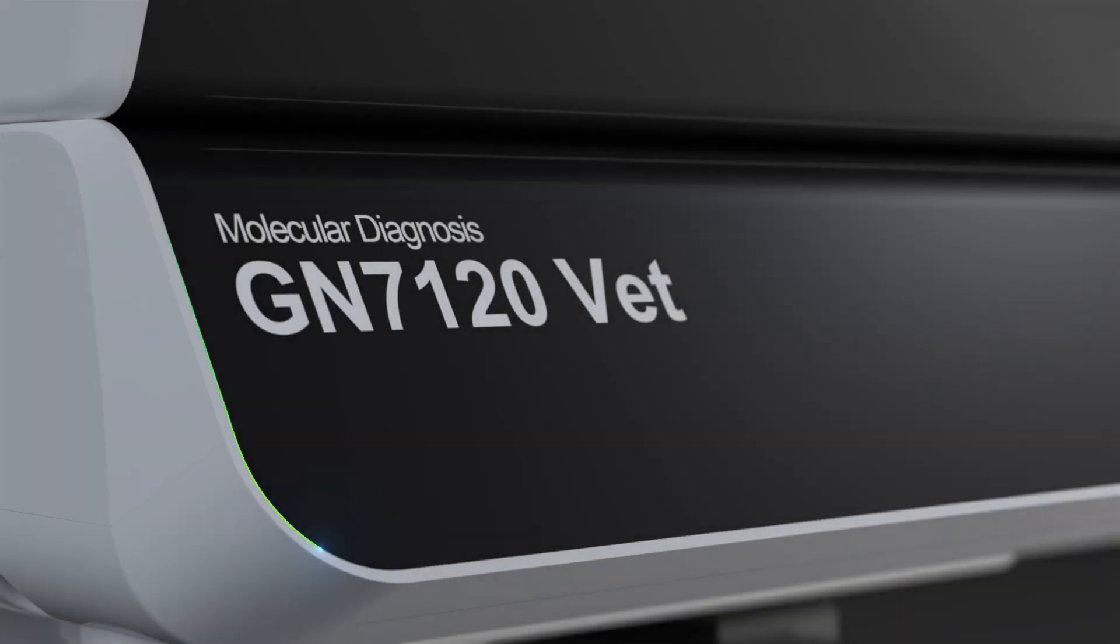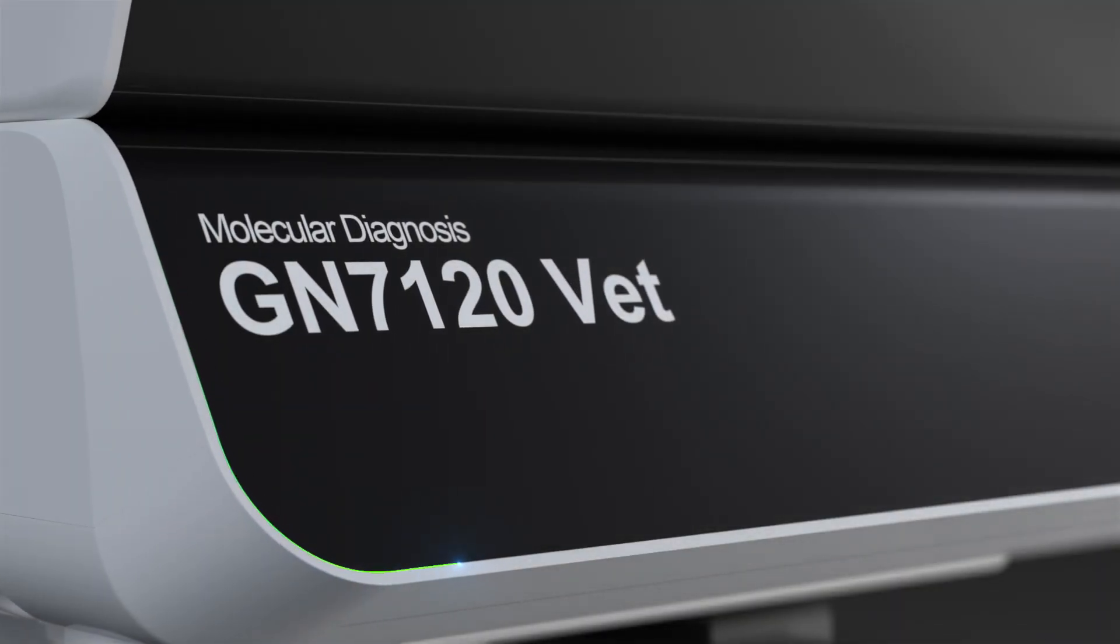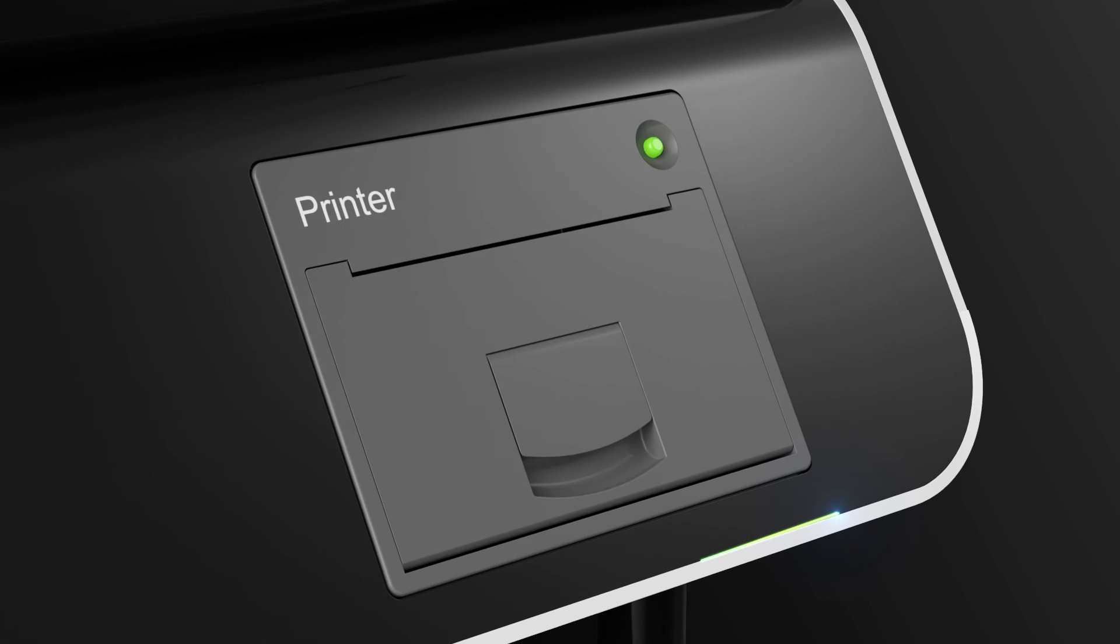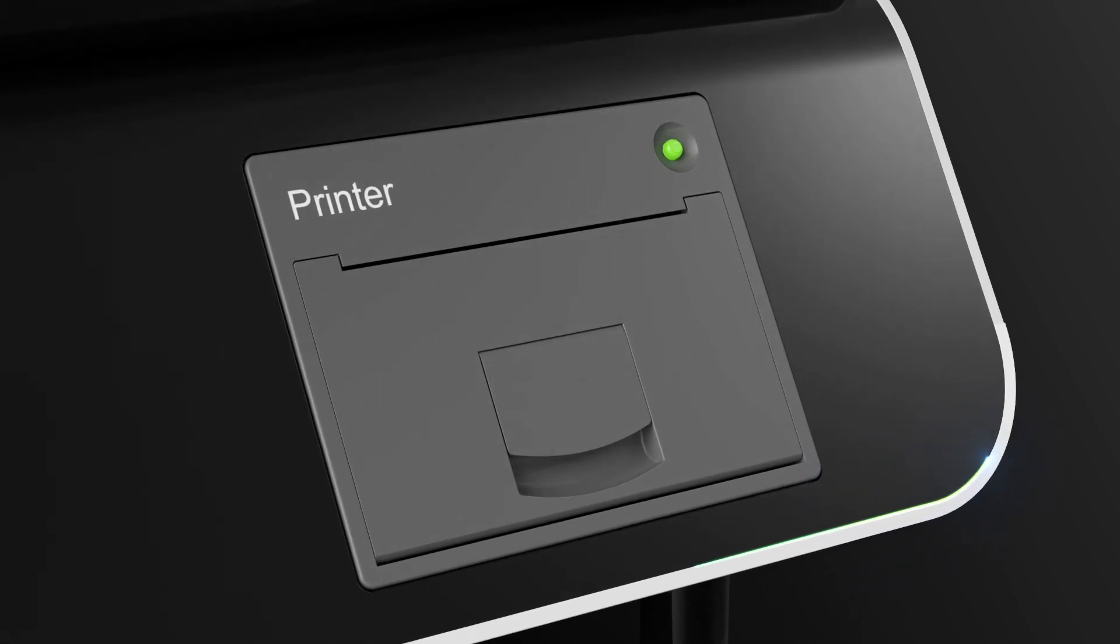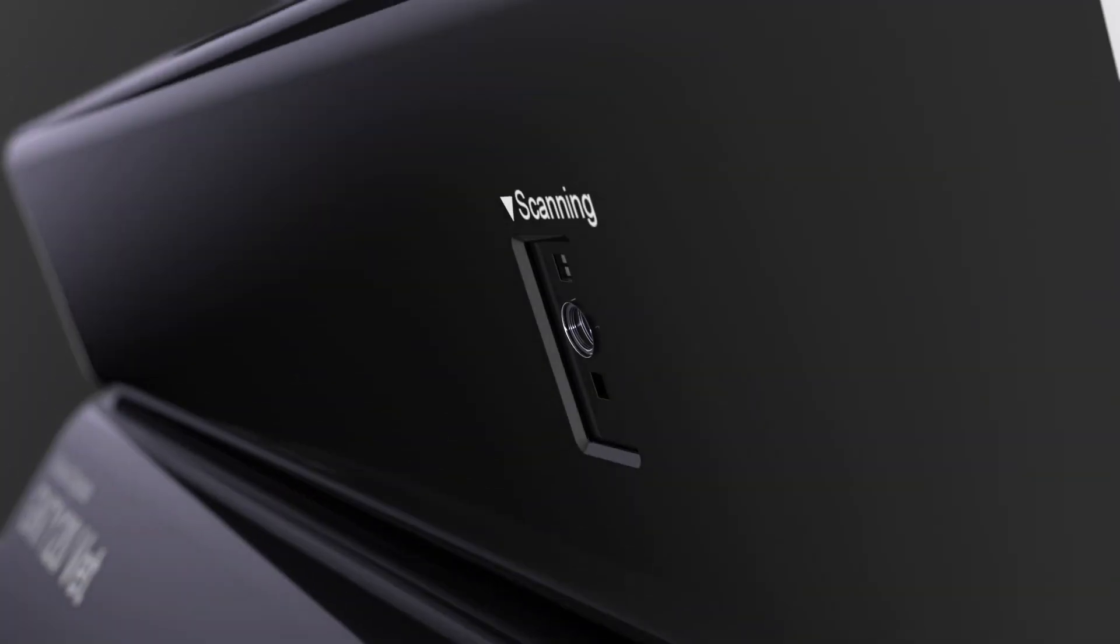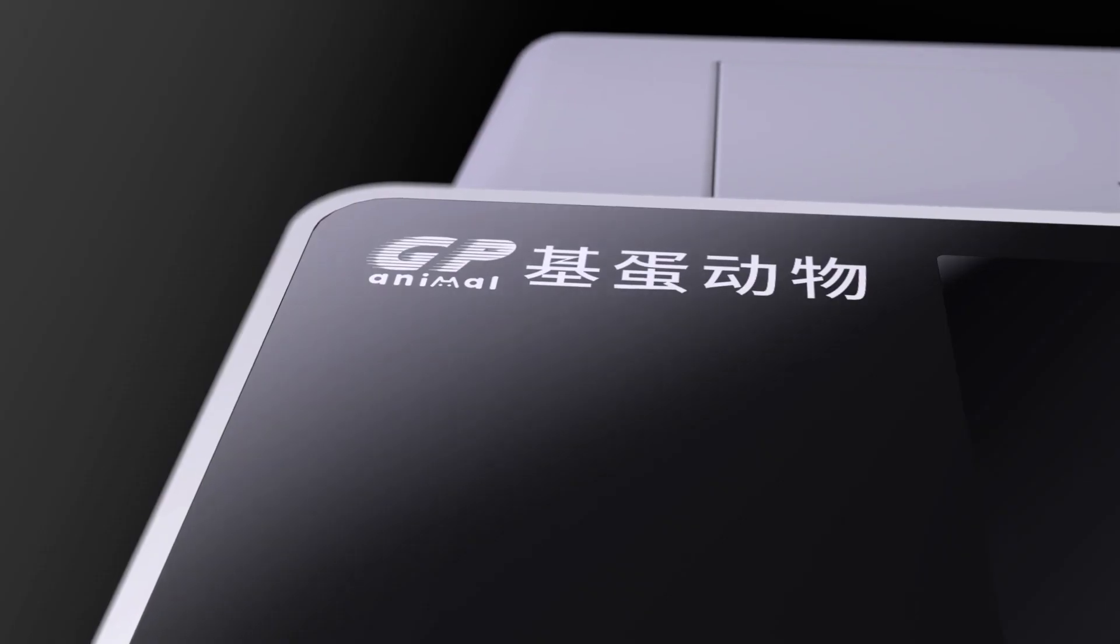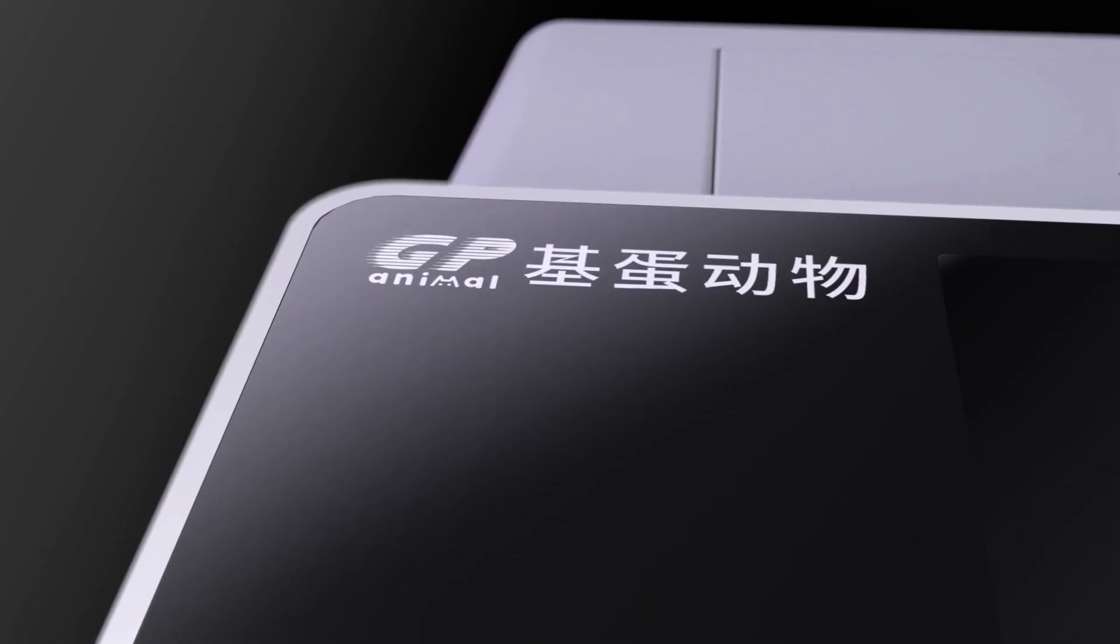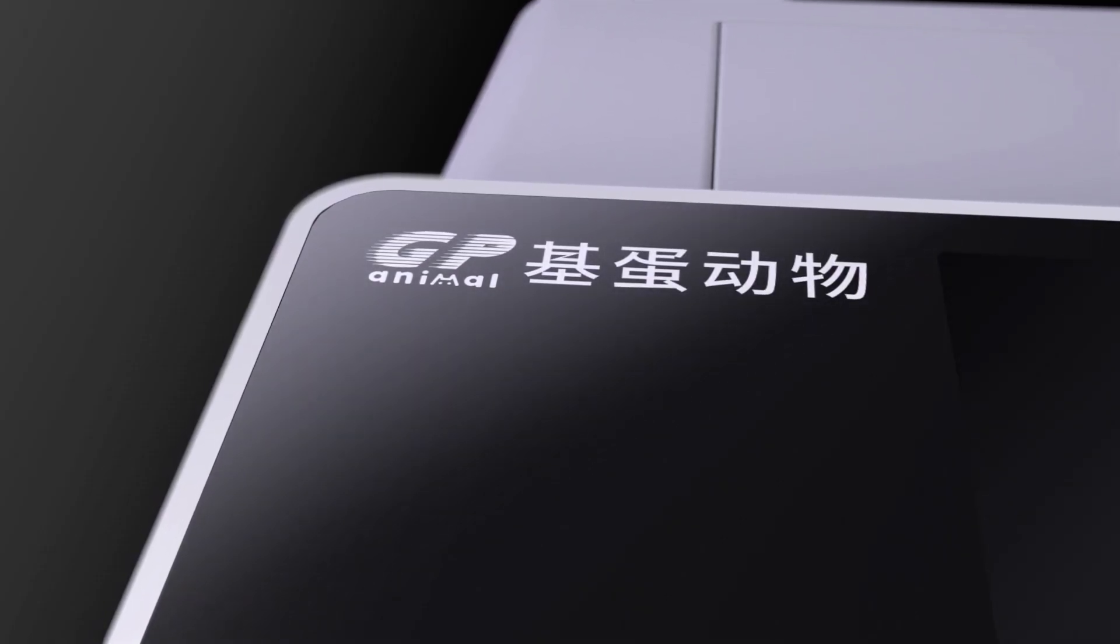G10 Animal Medical, GN7120, VETXO PCR system, breaks the technical limit of conventional nucleic acid tests.